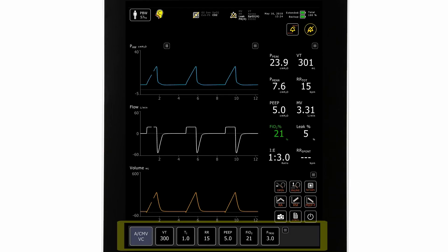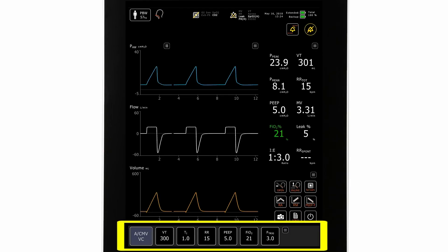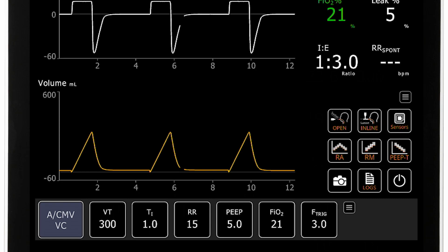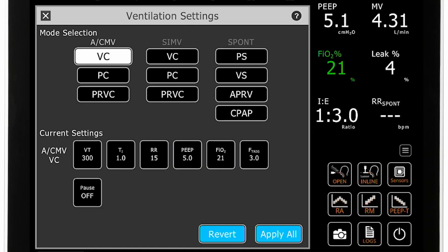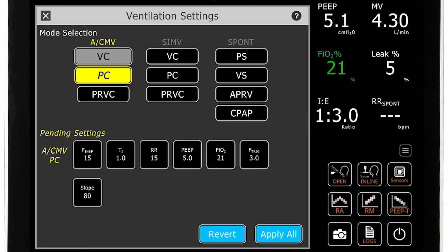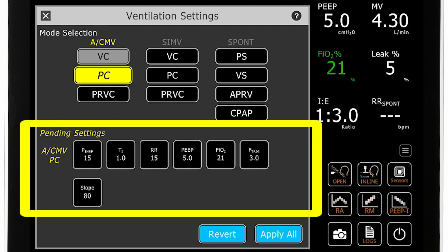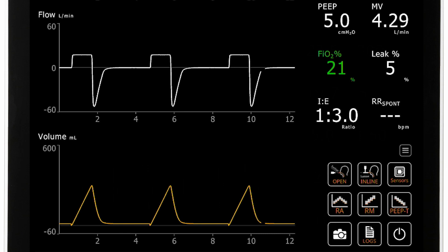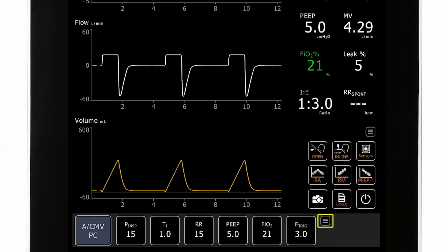Next is the modes and primary controls area. To change the mode, the clinician touches the mode button to open the ventilation settings dialog box. The clinician can then select the new mode, pre-adjust the primary ventilation controls pertaining to the new mode, and then press the apply all button to initiate the new settings. Additional ventilation controls can be accessed by the expansion button.